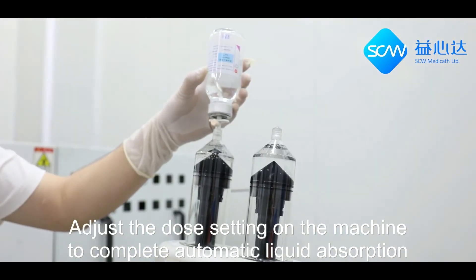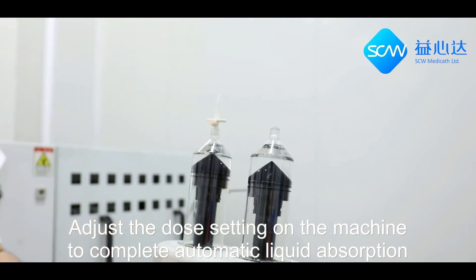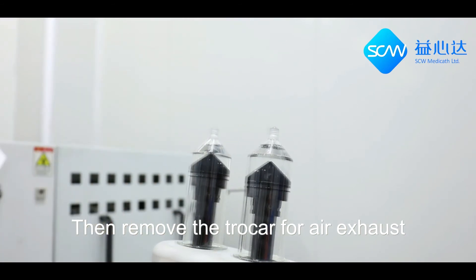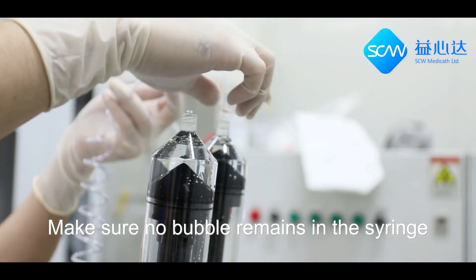Adjust the dose setting on the machine to complete automatic liquid absorption, then remove the trocar for air exhaust. Make sure no bubbles remain in the syringe.